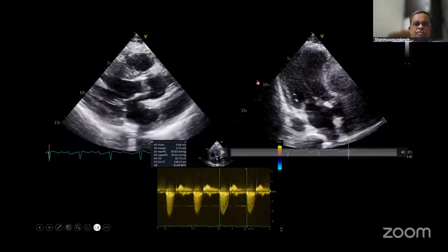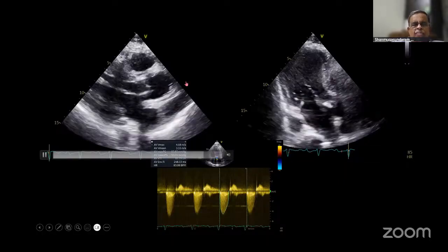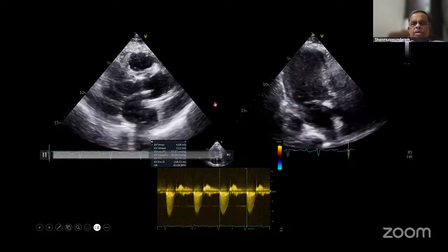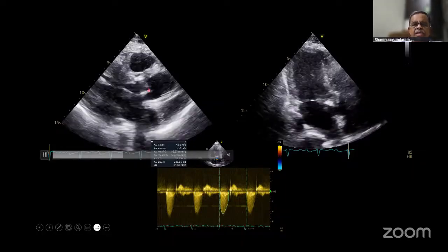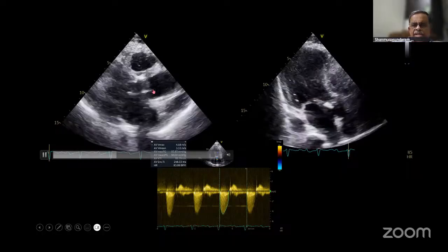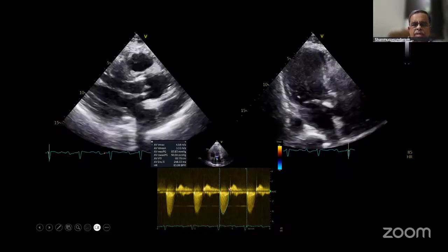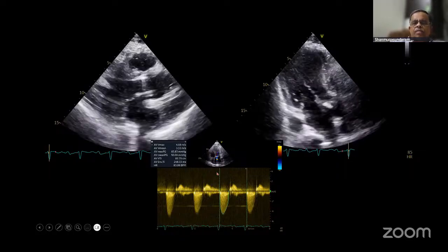Here is an example of someone who had undergone aortic valve replacement with a tissue valve a month ago, comes with fever of 1 week duration, transthoracic echo. These are the structures of the prosthetic valve. In between, you could see some bright structure. This is the prosthetic aortic valve, except that it is slightly more thickened. The mobility is not restricted. I can't see any vegetation. But if you look at the gradient, it is much higher than what was registered when the patient got discharged.